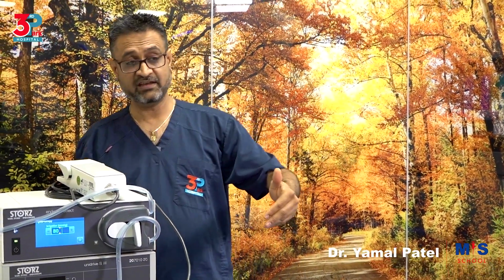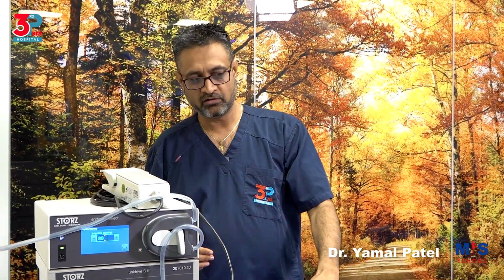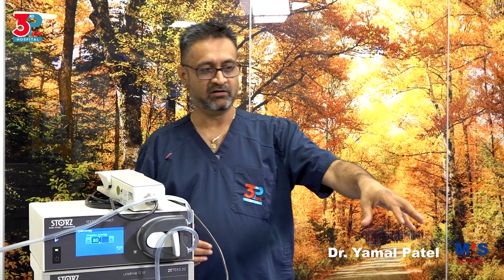Because you will be having leakages through the cervix into the floor, into the bucket, or on the drapes, or under the patient. Second thing, you will have fluid that would be intravasating through the uterine vessels. You will be having fluid that will be intravasating into the patient's abdominal cavity through the tubes.